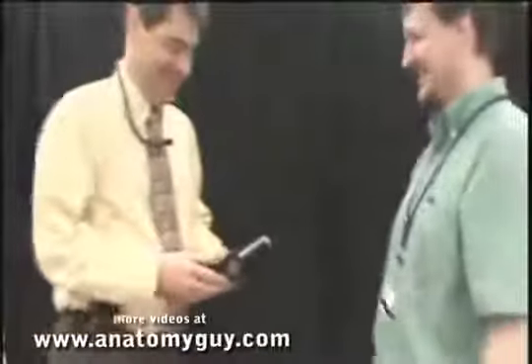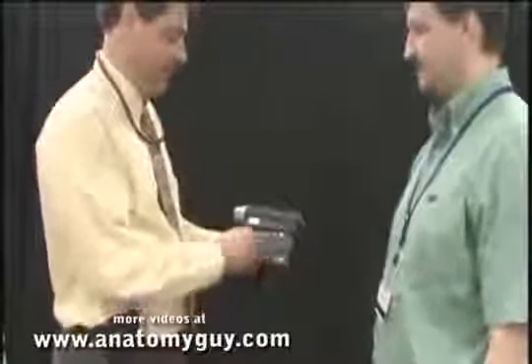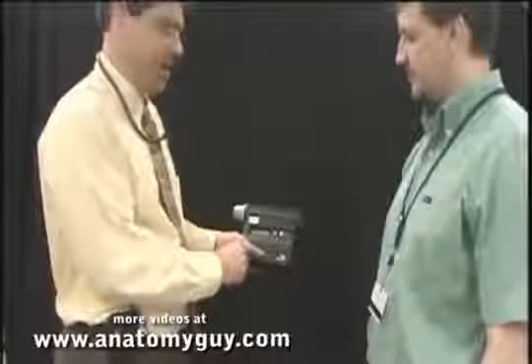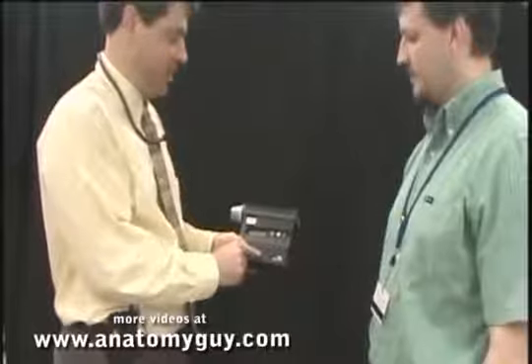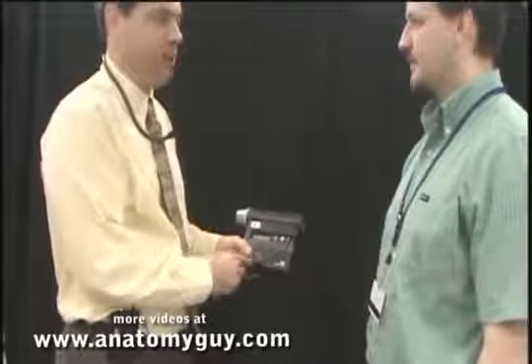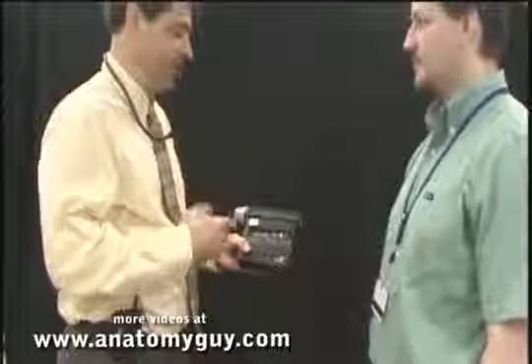We're about to bring in our standardized patient. Dr. Goodmurphy has to do this every year because he's exposed to formaldehyde, so he's well schooled in how to do this. So I've hit test, it'll say steady, and I'll give instructions to Dr. Goodmurphy. Dr. Goodmurphy, take a huge deep breath in, hold it, fill up your lungs as much as you can, put your whole mouth around it, and blow out as hard and as fast as you can.